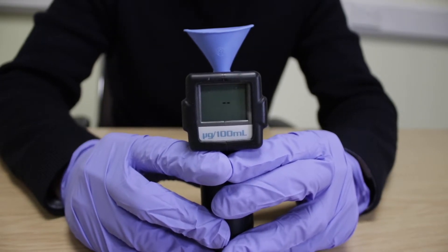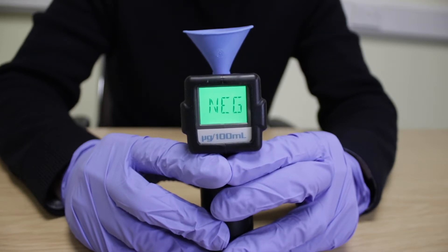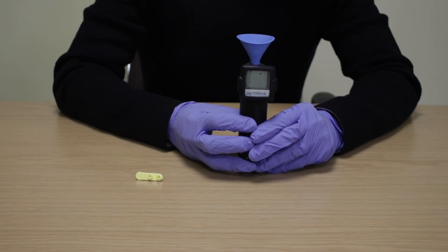The device will have a dash running across the display signalling that it is analysing the sample. The device will then show NEG if no alcohol is detected, or POS if alcohol has been detected. If alcohol is detected, you can carry out a direct test to establish how much alcohol is present. To repeat a passive test with another donor, press the on button and repeat.